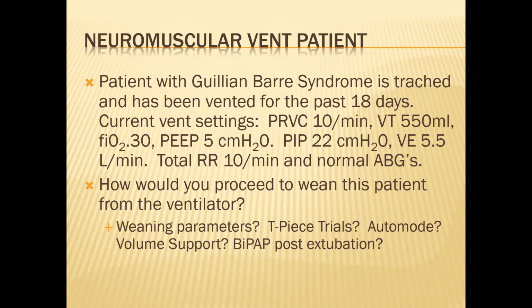it used to be the most common way was to switch over to SIMV, whether it's PRVC or another mandated breath. Give them some pressure support, and then every day you cut that down a little bit more and a little bit more and let them breathe more on their own. But it never gives the patient a rest. So that's why doing CPAP and pressure support trials is better.